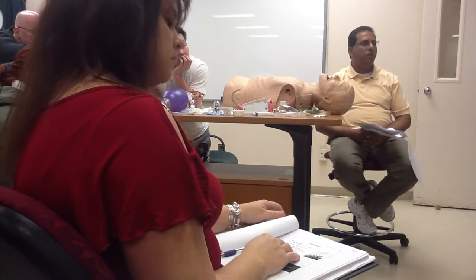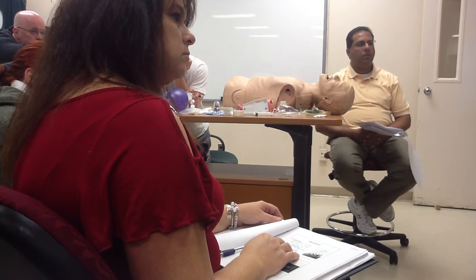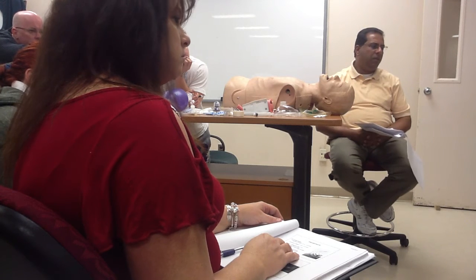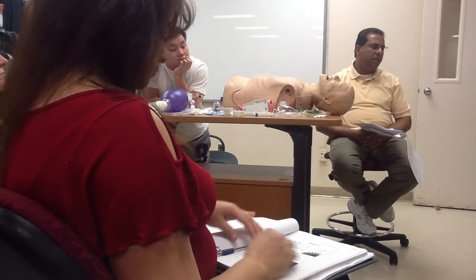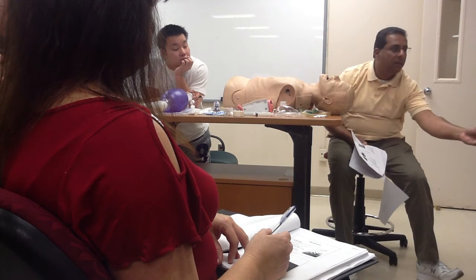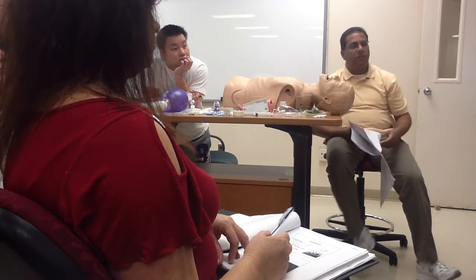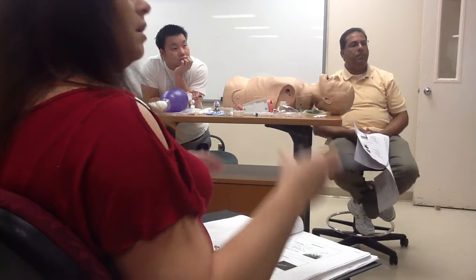But let me pass this around. The hole, you can barely see the hole. Not big. I don't think they do a lot of help. The literature says that they do when they're used properly. The hole you're looking at is over here, right above the cuff. Yeah, right above the cuff.